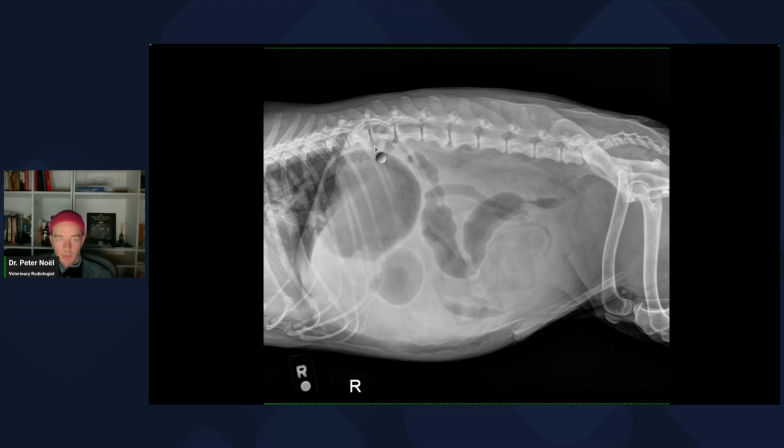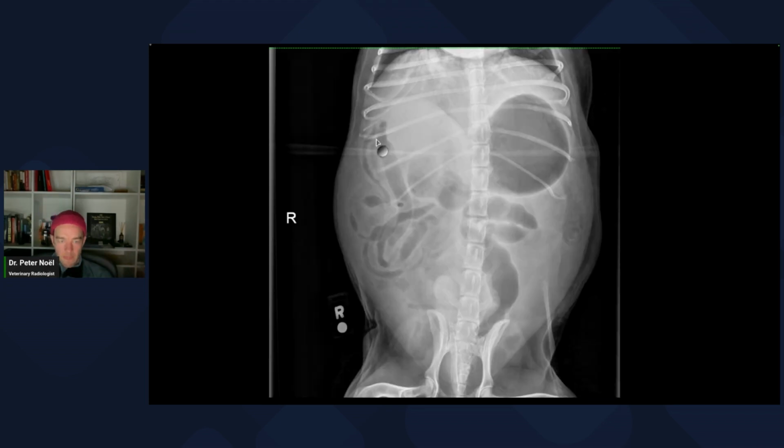Yeah, this is gas overlying the vertebral column. You know, this loop right here is a little bit corrugated. You see how this is nice and smoothly undulating, and this is more like a little bacon strip. So this loop is angry, and it's reacting secondary to either the peritoneal process or intrinsic intestinal disease, or both. This is the colon. Okay, this is the big stomach.